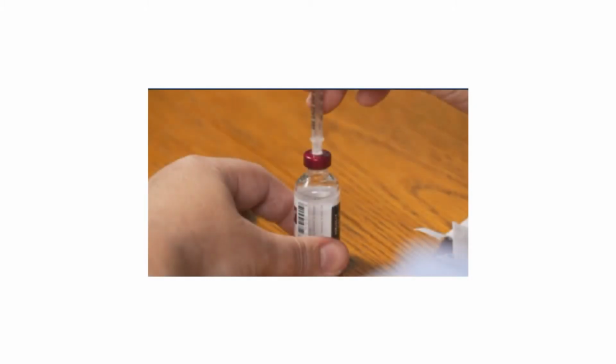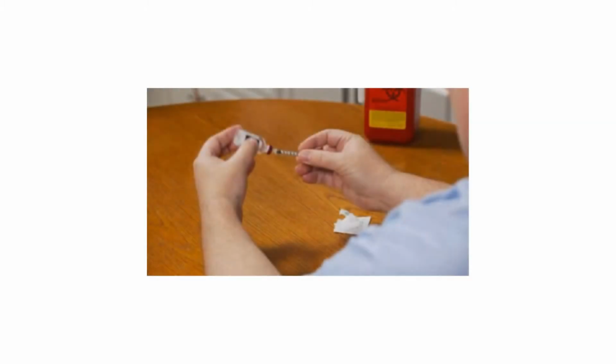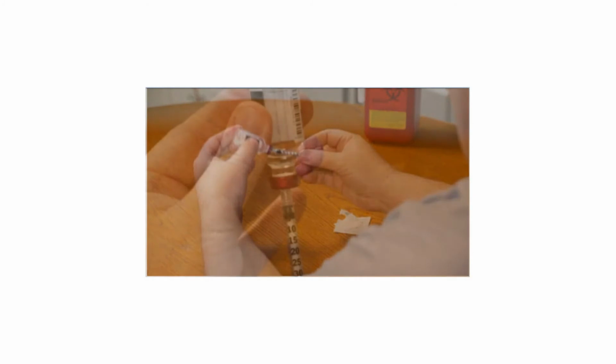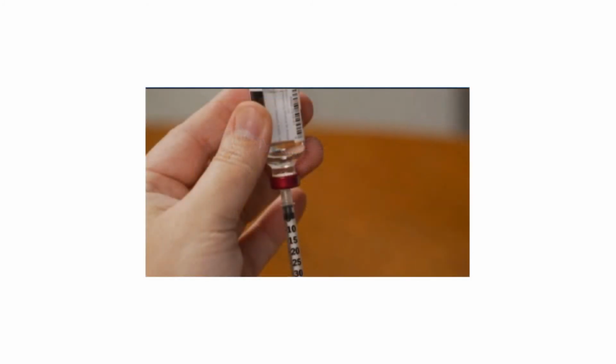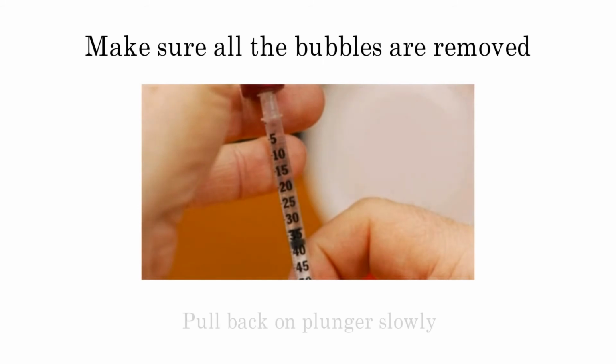Holding the insulin vial firmly on a flat surface, push the needle into the stopper and push the plunger down so that the air in the syringe goes into the bottle. The air replaces the amount of insulin you will withdraw from the vial. Keeping the needle in the vial, turn the vial upside down. Pull the plunger down until the top of the black plunger reaches the correct dosage on the syringe.